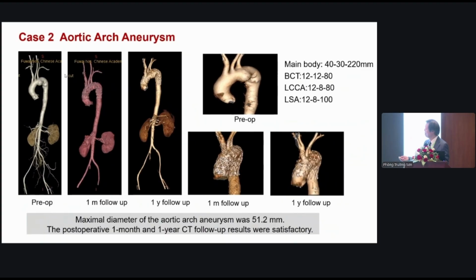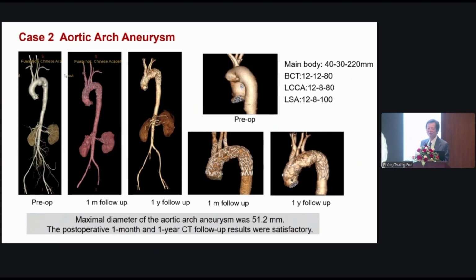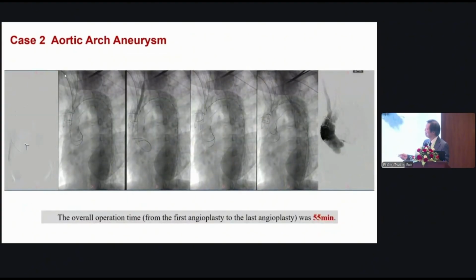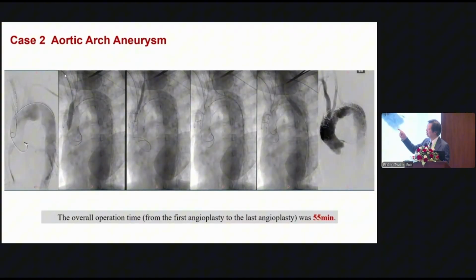The aneurysm we have done, it's easy for you to do it. This case, we spent only 55 minutes. So first, you perform angiogram. Secondly, you deploy the main body.